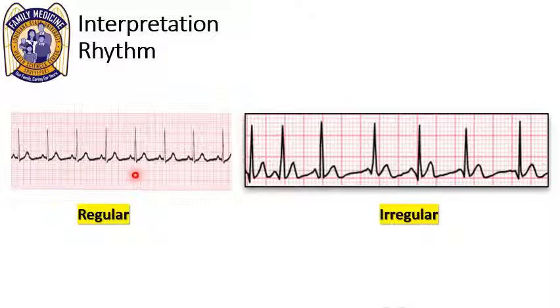That's your calipers. 21st century stuff. So on this right here, you see the irregularity of it. You start at the 0.04 and then you end well above the 0.04. Then you go a little bit farther, but you notice you have two boxes in between. This is obviously an irregular rhythm, and knowing that our two or three irregular rhythms are AFib, AFib RVR, and A-flutter as well.